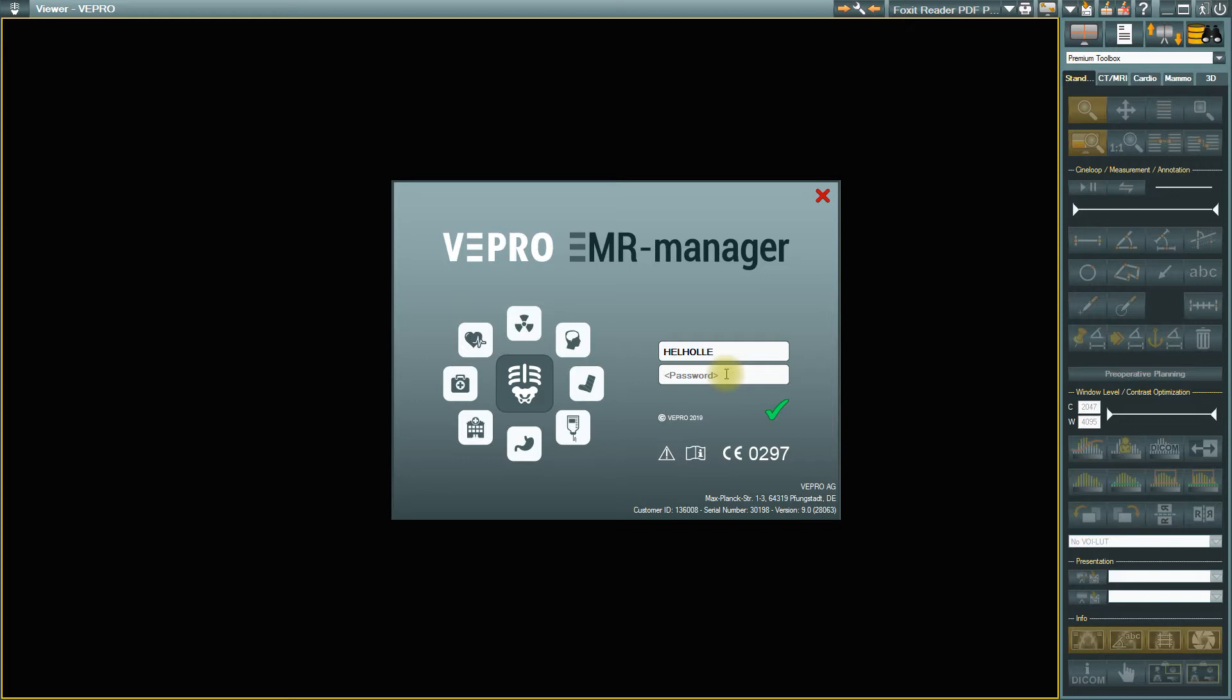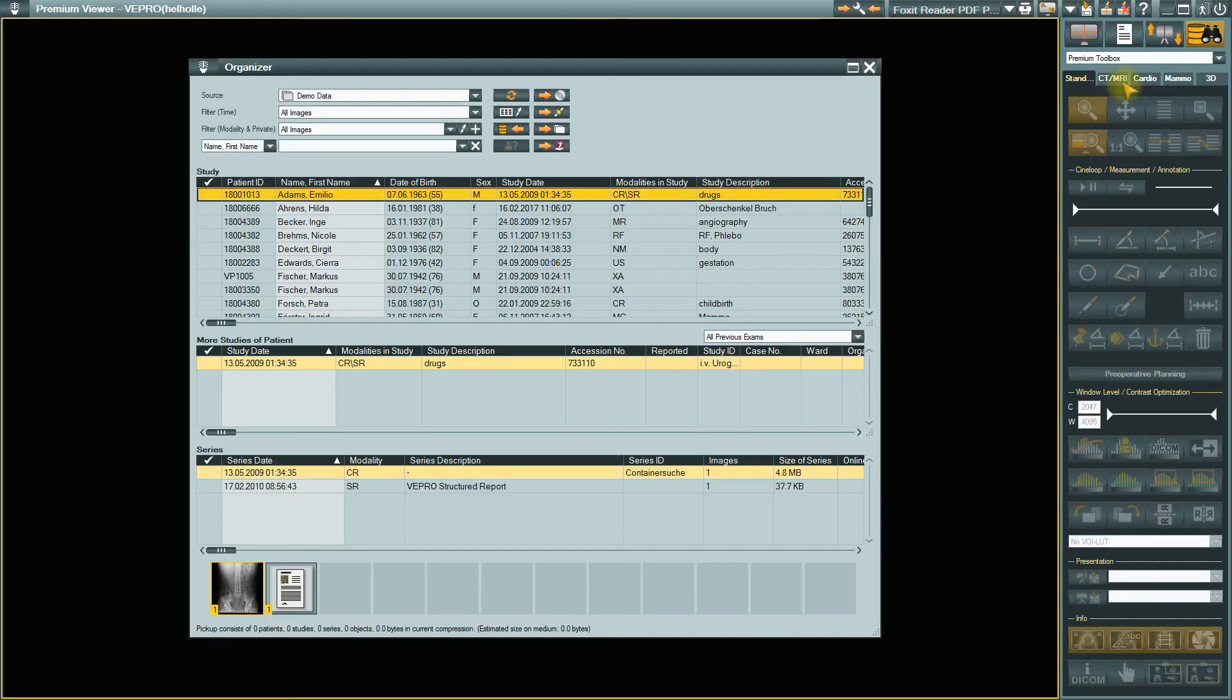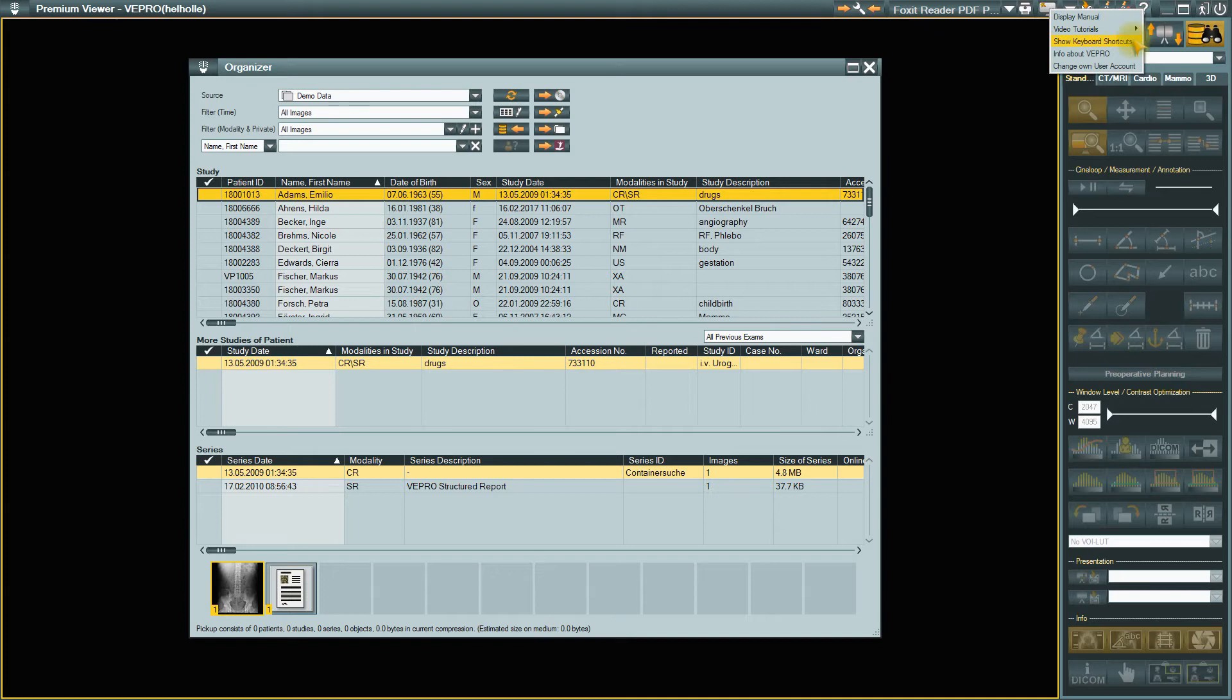If you are already logged in as a user, you can change your user data via the User Management section. To do this, click on the question mark icon in the title bar and select Change My Account.